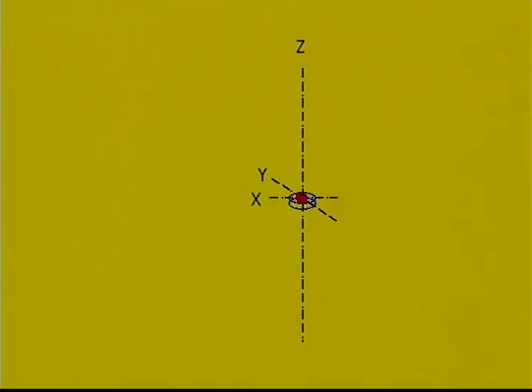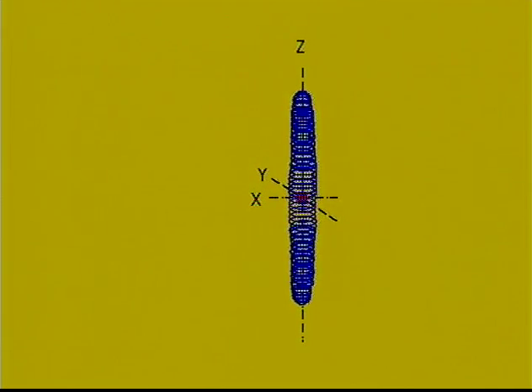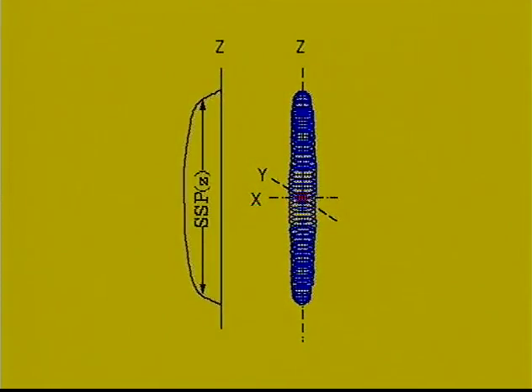The advantage of using the bead as a point source is that we can generate both the two-dimensional point spread function in the XY plane, or in fact the ellipsoid, the volume resolution, the 3D point spread function of a CAT scanner. In fact, when we take the profile along the z-axis, we are generating the slice sensitivity profile in the z-axis. We can alternatively generate this profile by stepping or moving the bead a small increment at a time, and by monitoring the peak CT numbers, we can generate the slice sensitivity profile.